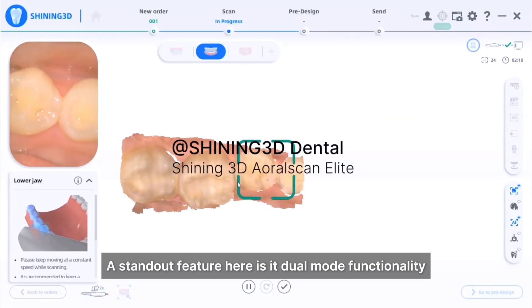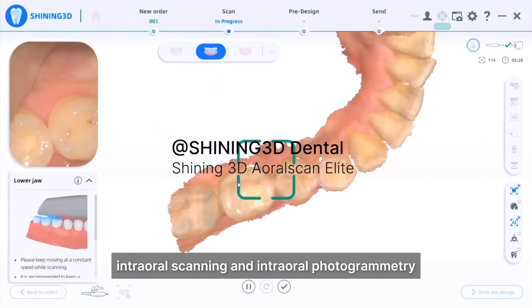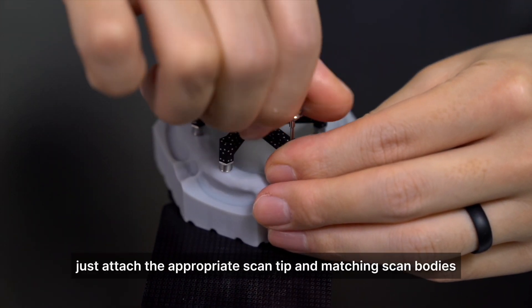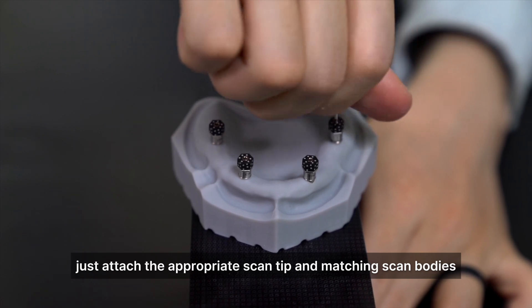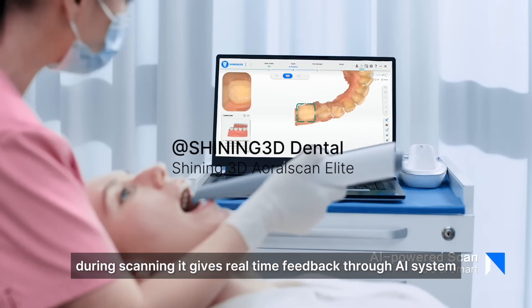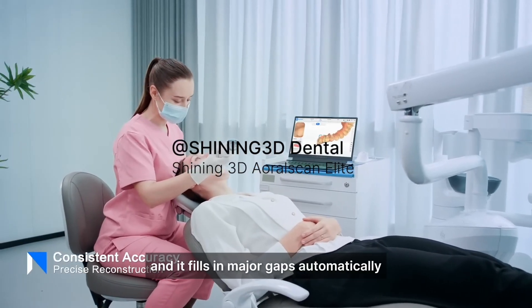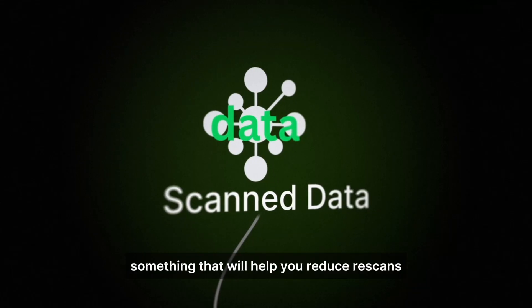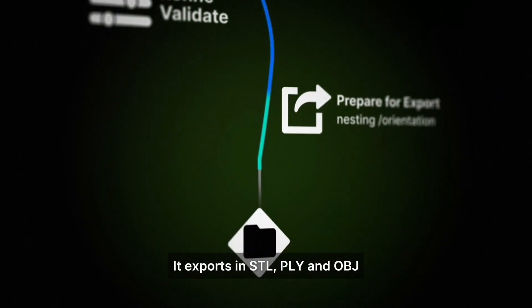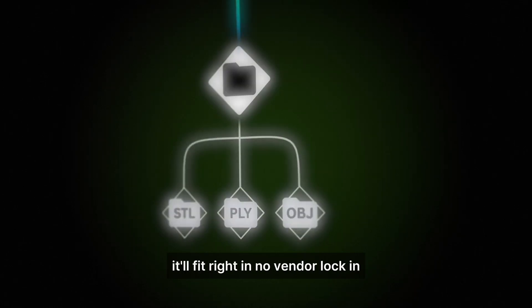A standout feature here is its dual-mode functionality. You can switch between standard intraoral scanning and intraoral photogrammetry for full-arch implant precision. Mode switching is simple — just attach the appropriate scan tip and matching scan bodies. During scanning, it gives real-time feedback through AI systems. You can actually see where to move next, and it fills in major gaps automatically, something that will help reduce rescans. It exports in STL, PLY, and OBJ, so if you're already working with third-party CAD/CAM, it'll fit right in — no vendor lock-in.